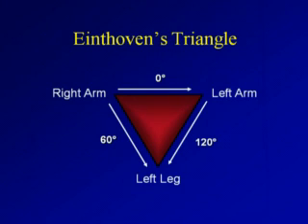So it's essentially like looking down a tube, and if somebody's waving their hand up and down, you only see what their hand's doing when it's in front of you, in front of the tube. So bipolar leads can only see in the direction that they point. And if we put the bipolar leads on the arms, right arm to left arm, then that lead can only see what's happening in a horizontal direction. Now, the heart electrically acts like a battery that changes voltage over time. So when it does so, it creates an electrical vector. This bipolar lead is only going to see what's happening in its own direction.